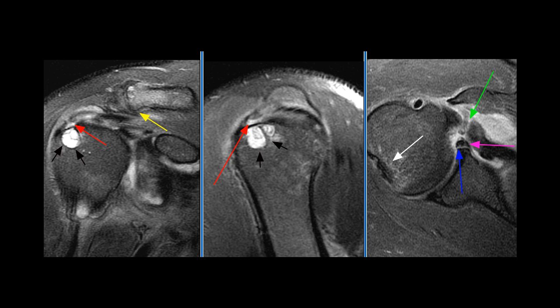The findings are consistent with a rim-rent tear along with Bankart lesion and torn subscapularis in concert with Hill-Sachs lesion.